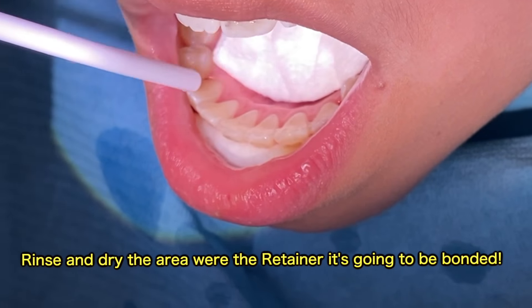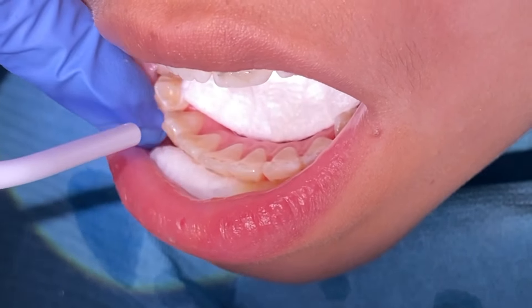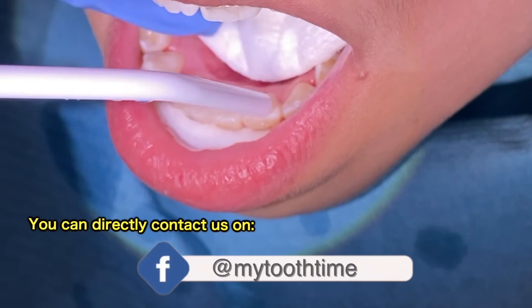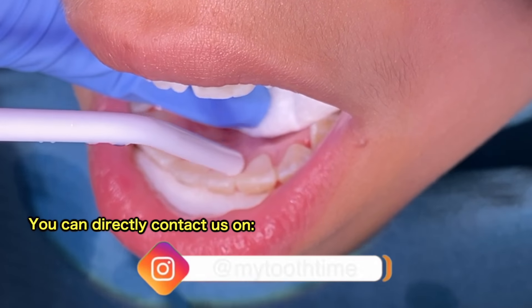You rinse it off and make sure that the area is really dry and isolate it, because any moisture will interfere again with bonding the three-to-three. Once it's dry and chalky, then you can go ahead and apply the bonding material.